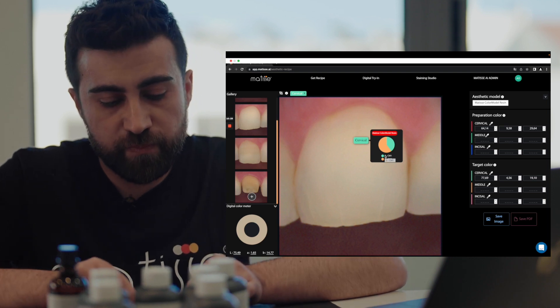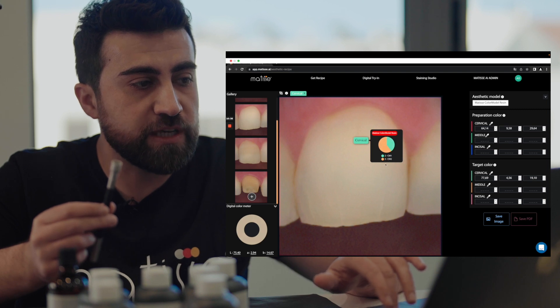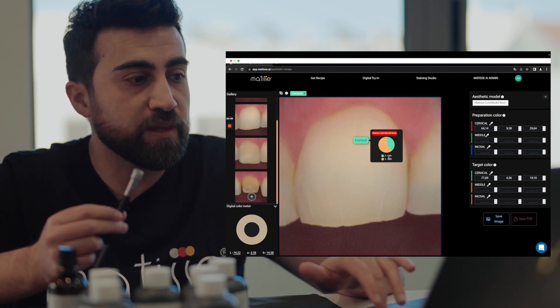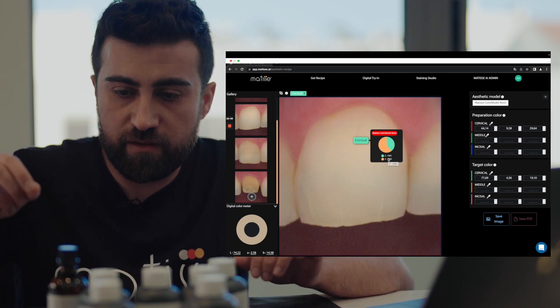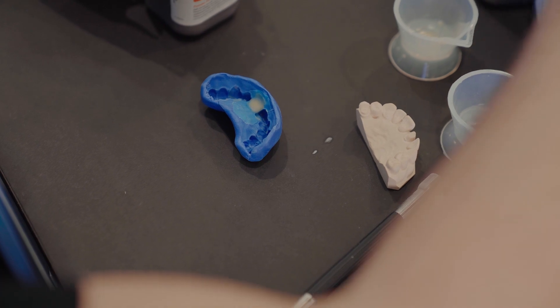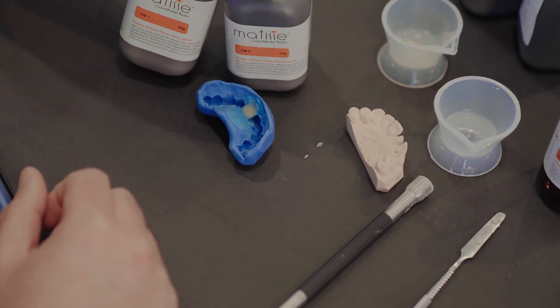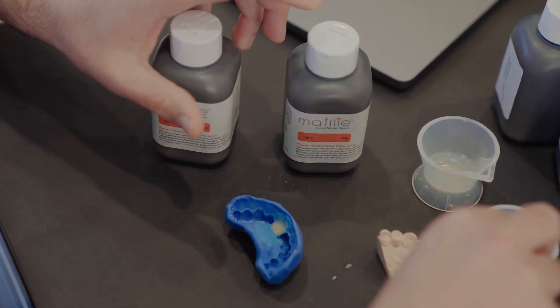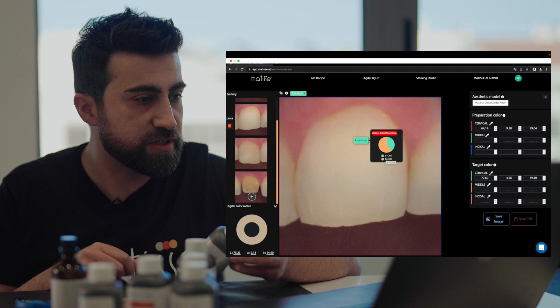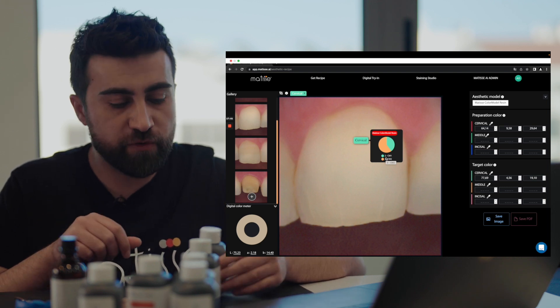To make a full model we need 20 scoops of the big portioner. This ratio of 2 and 3 is for one tooth, so if you want to make a full model you need a maximum of 20 scoops. I will make this recipe four times — we need CM1 and CM2. I will take 8 times CM1 and 12 times CM2, because we need 20 scoops to make a model from canine to canine.